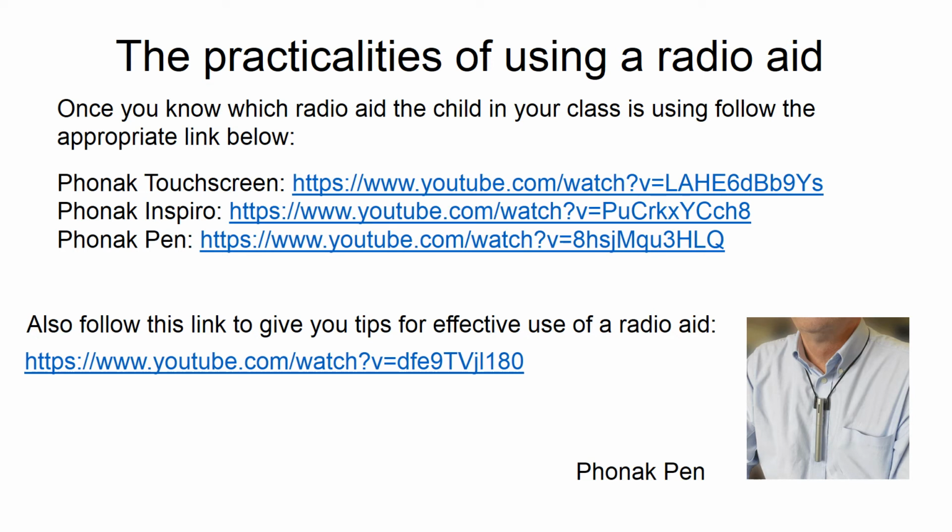One thing not mentioned in these videos is how expensive a radio aid system is, roughly about £2,000. Please help the deaf child or young person to follow routines for setting up and storing of their equipment so that it does not get broken or lost. Receivers are especially small and very expensive.